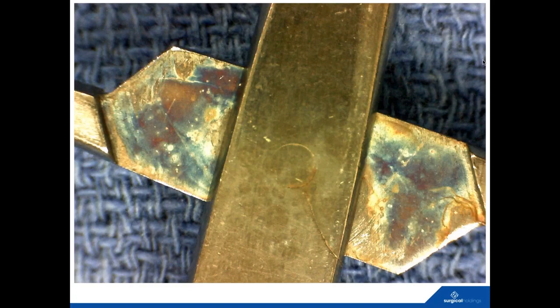Again, you've got a mechanical working part, and generally speaking, this is something after the device has been in use for quite a while, but very common. Also, you'll see the discoloration at the back of the box joint as well, and that could well be from an issue with water that has damaged the surface of the steel. It could be a chemistry thing, or sometimes even some different colorings are as a result of silicates.